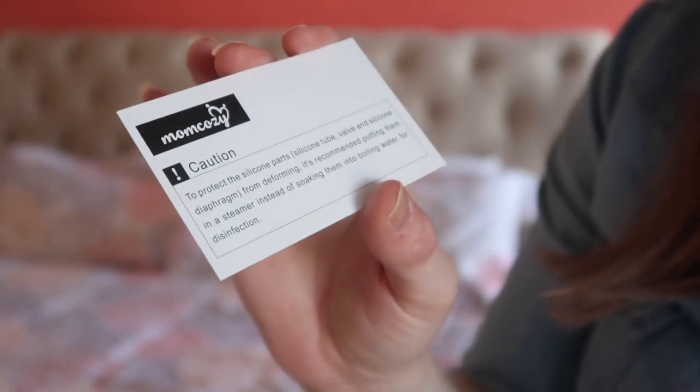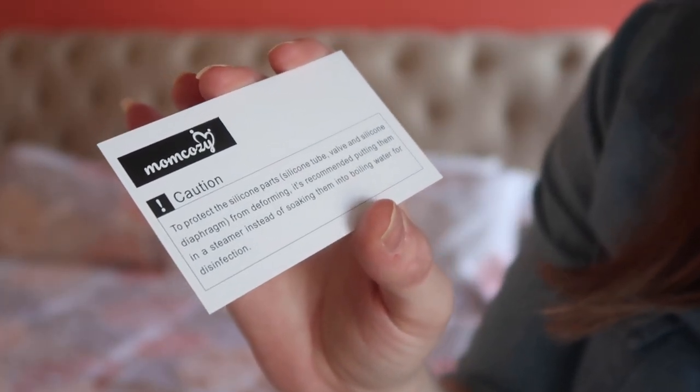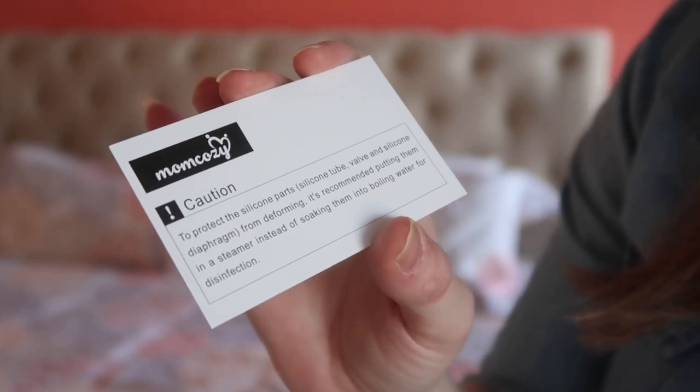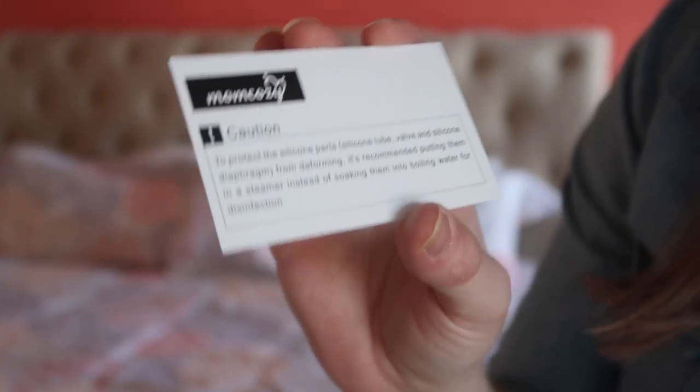One tip that came with it: to protect the silicone parts from deforming, it's recommended to put them in a steamer instead of soaking them in boiling water. If you're looking for a super affordable pump for traveling, or even just to keep one upstairs and one downstairs, this is an awesome option. I think I'm really going to like it.